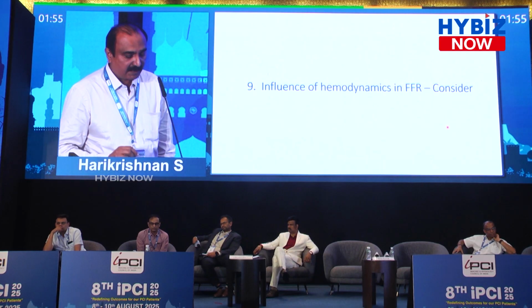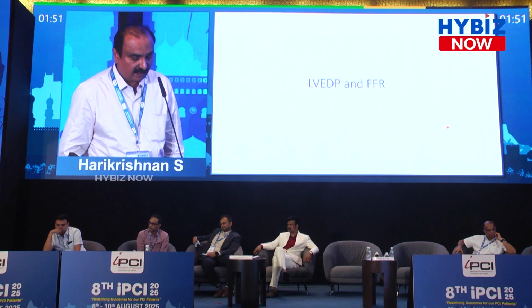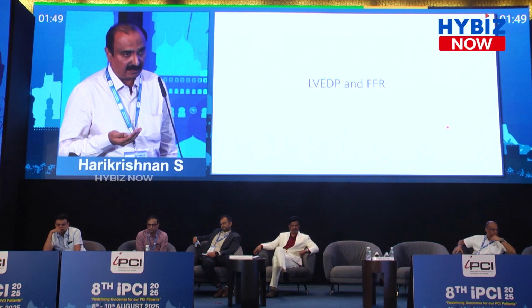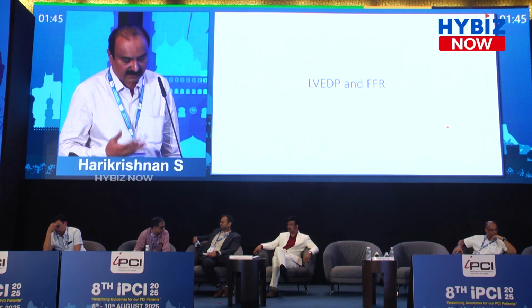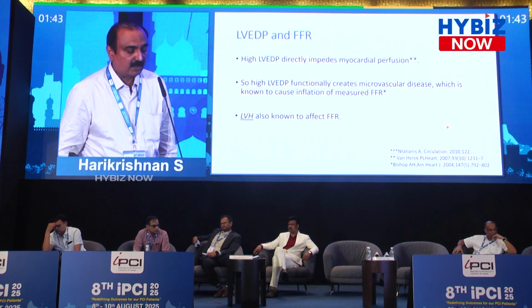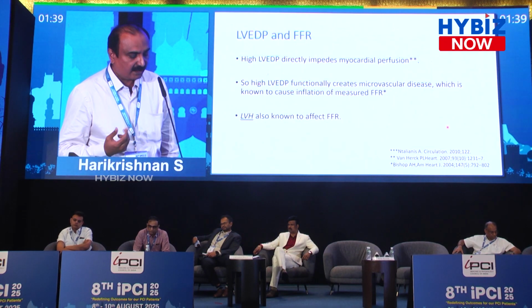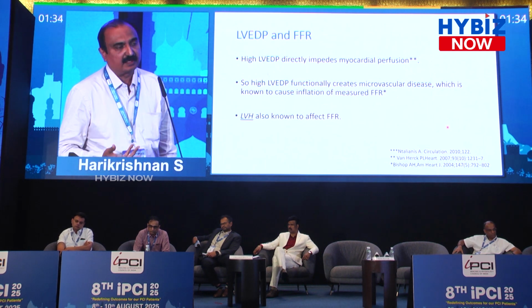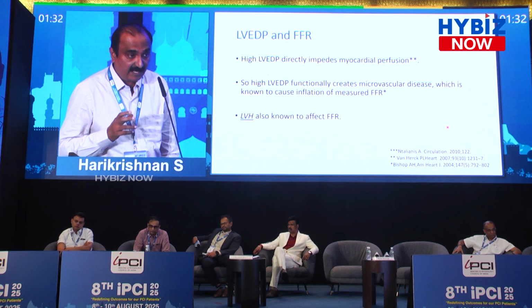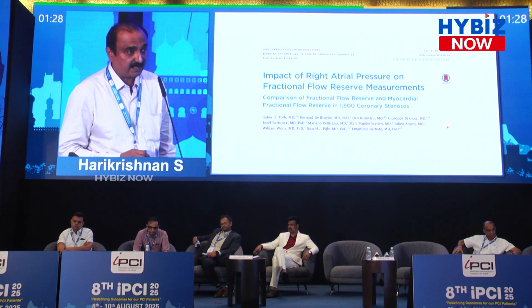Influence of hemodynamics, this is the last part I am going to discuss. LVEDP can be elevated and can affect the FFR values, because high LVEDP directly impedes myocardial perfusion, so it creates a functional microvascular disease which can cause overestimation of the measured FFR. LVH can also affect the FFR. Then right atrial pressure can also affect it.